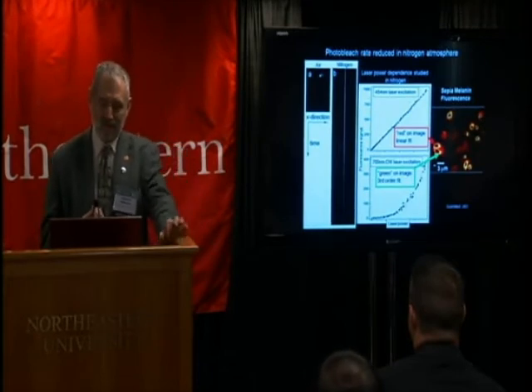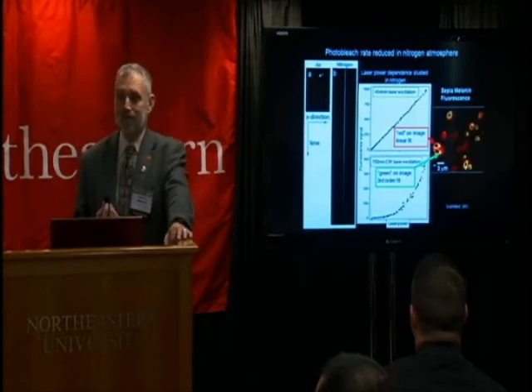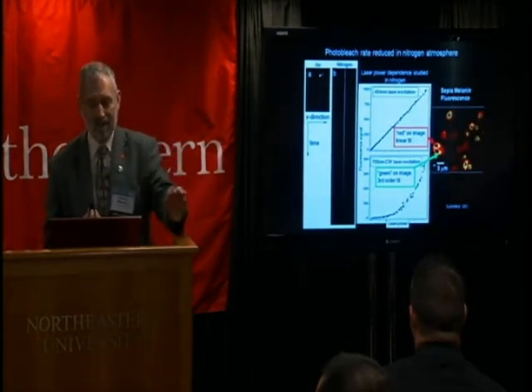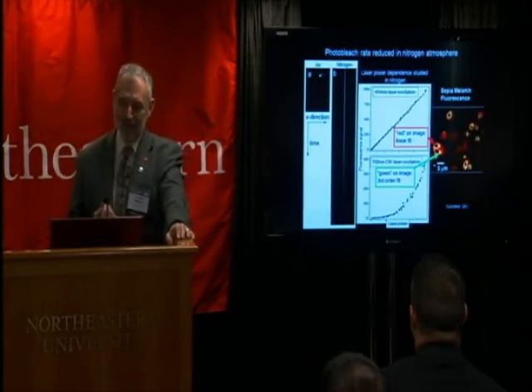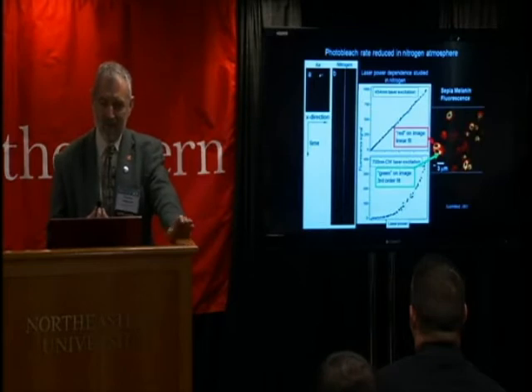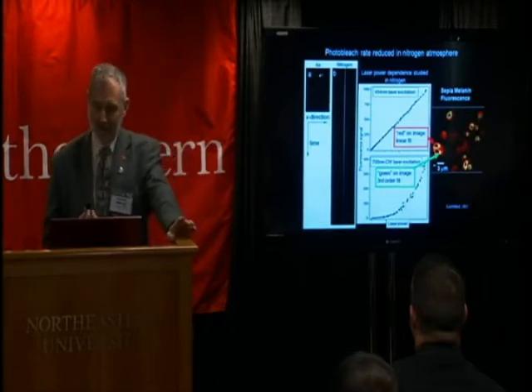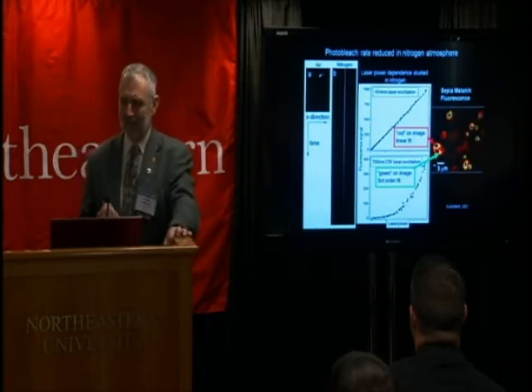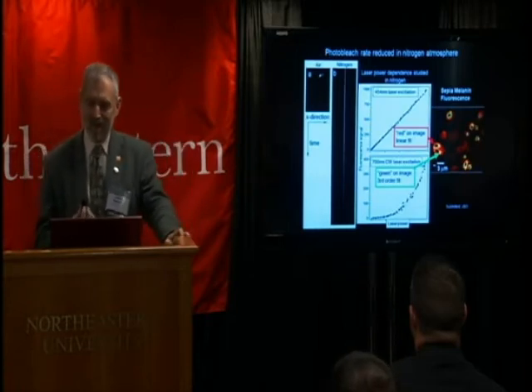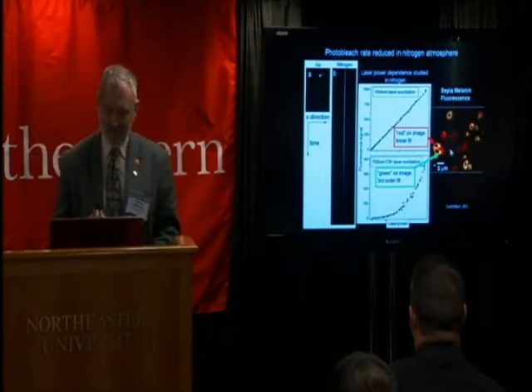That allows us to do experiments like this middle panel where we look at the power dependence, the excitation power dependence of the emission. And we see that for the blue excitation we have a linear dependence, which is traditional for fluorescence. For the infrared excitation we have not a second order fit, which we thought for a two-photon process, but a third order fit indicating that it's a three-photon process. And once again, I just reproduced this picture here so that you can see where those are occurring.